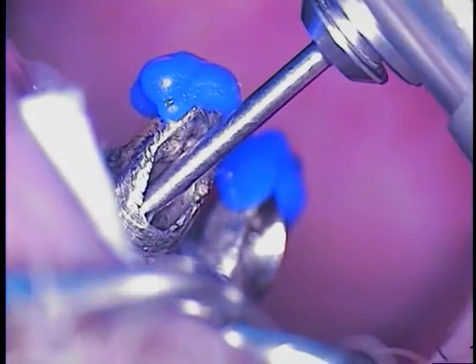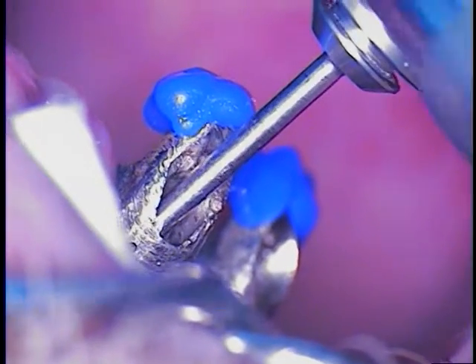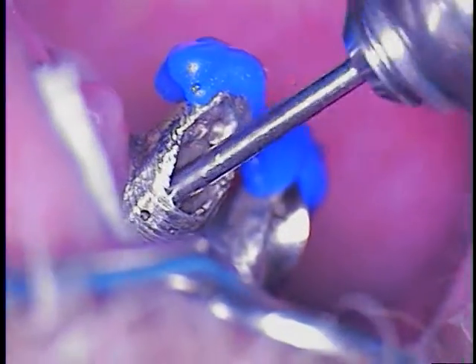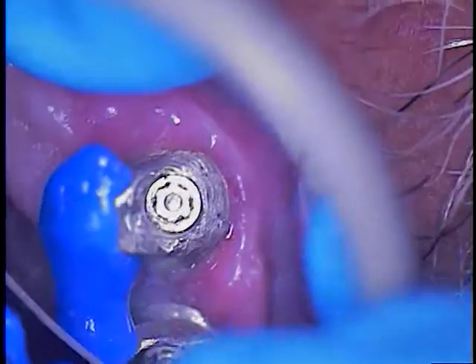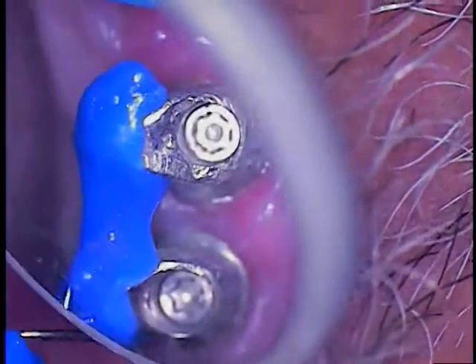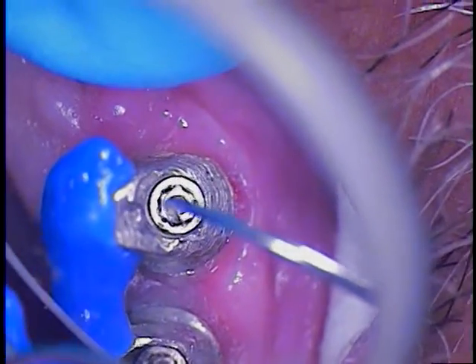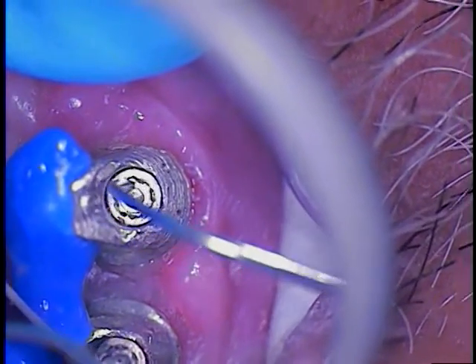We got it. How about that? We got it. That's it. Beautiful. So when you study what you've got going, you realize that we don't know what's underneath there. I saw a little bit of swelling around the implant. You have to do one thing first, and I think the key is this index. Now we can take the screw out, see how it's spinning around, and we can replace that screw and just hand tighten it. We're going to take it all off, clean it, but there's going to be a lot of fluidity in there.